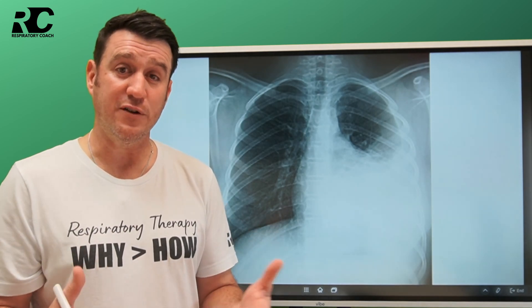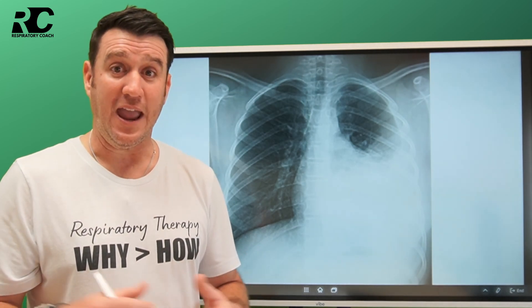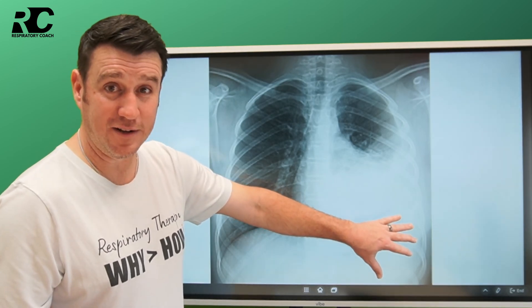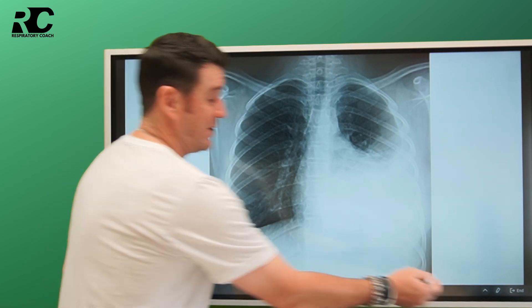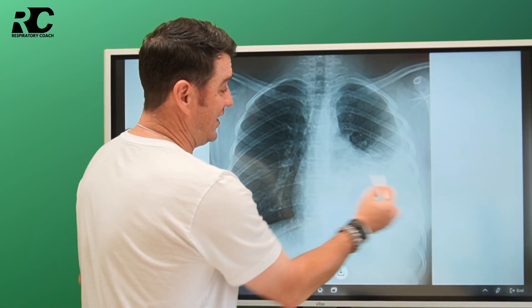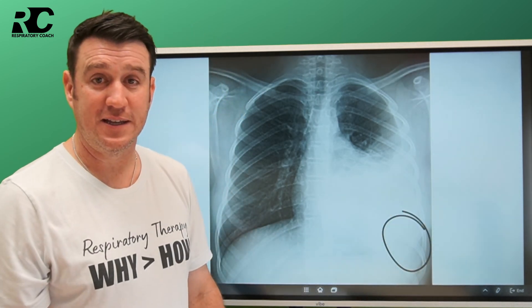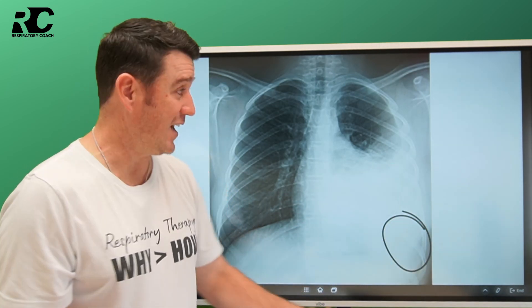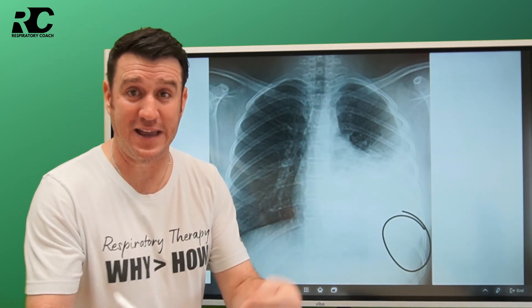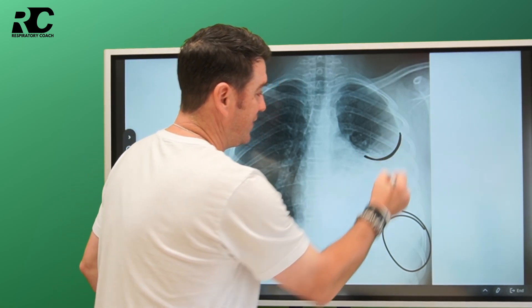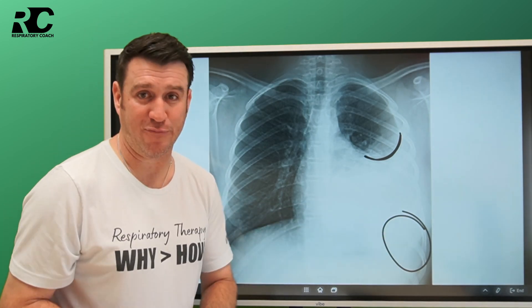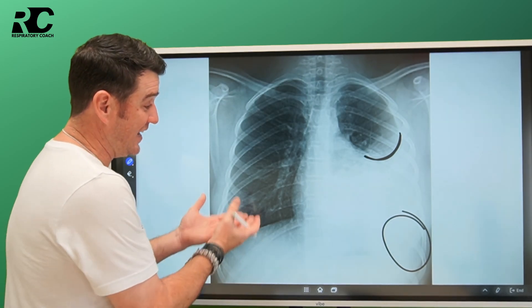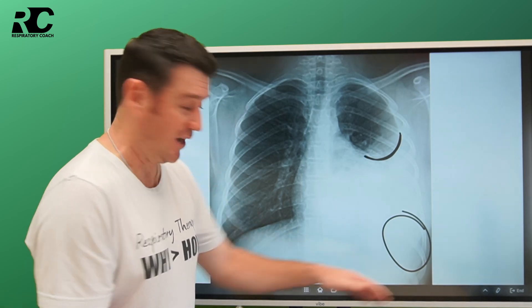On the next x-ray, we see something that looks different. We still see two lung fields, but they are definitely not equal. The lung field on one side of this x-ray is clearly different. I see a lot of radio opaqueness down in this region, and I can't visualize the left costophrenic angle. Where the aerated lung field stops — it looks like it stops somewhere right around there. I do not see a costophrenic angle on this side.